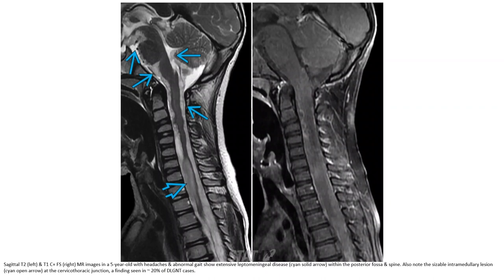This is a T2 and T1C+ fat-saturated MRI in a five-year-old with headache and papilledema. There is extensive leptomeningeal disease within the posterior fossa and spine. Also note the T2 intramedullary lesion in the cervical-thoracic junction, a finding seen in 20% of diffuse leptomeningeal glioneuronal tumor cases.